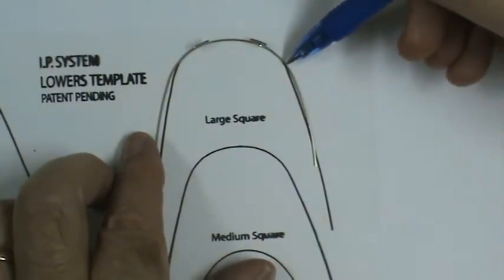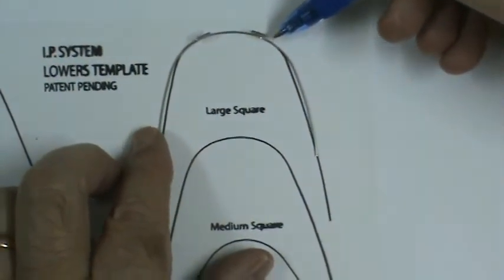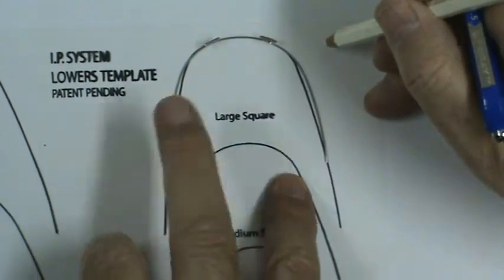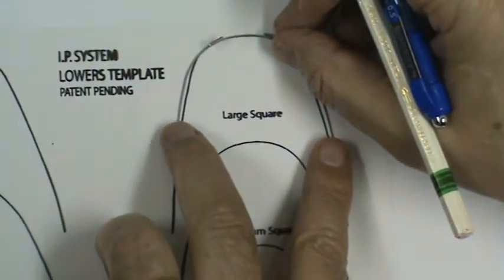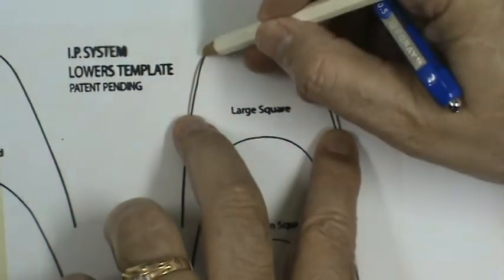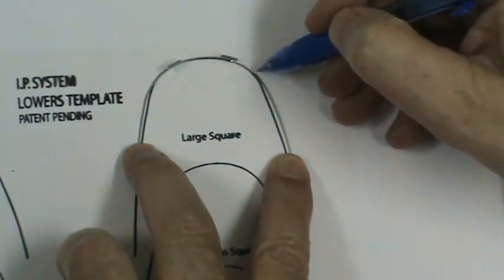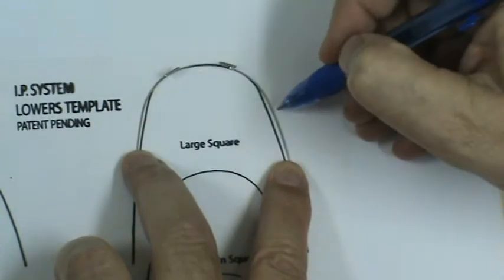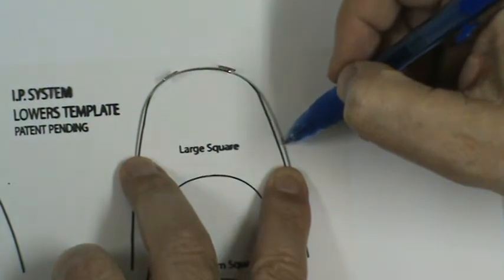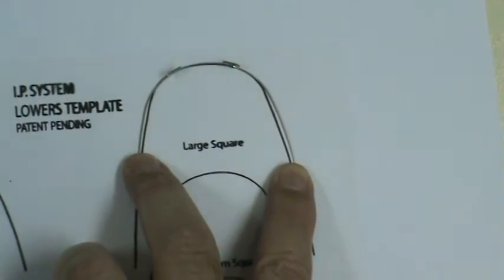Okay, now what we want to do, you can see that it fits our template until this point. We're going to take an arch marking pencil. We'll get it symmetrically on both sides, and we will mark the wire when it diverges from our master. So we're going to put a light wire plier here. We're going to bend this in just a little bit on both sides, and then you will notice we'll have to make another bend out to get rid of the toe in on the back.